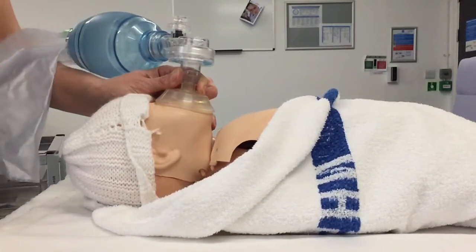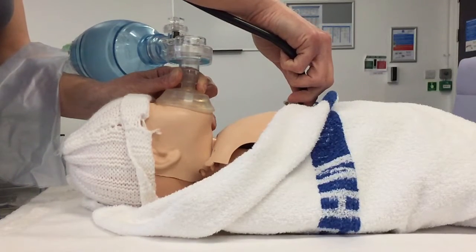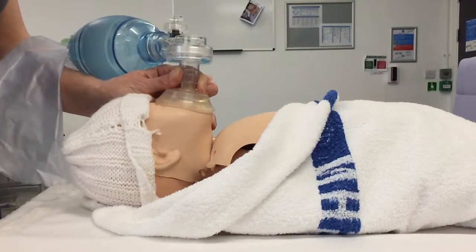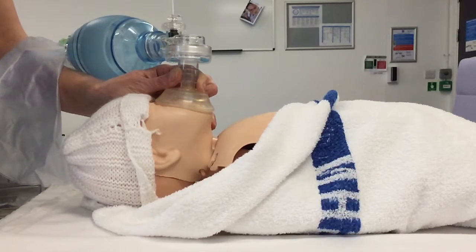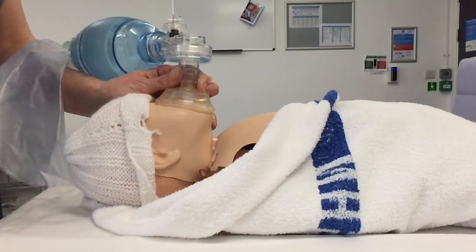Give five inflation breaths, then reassess baby. What's the baby's heart rate now? The heart rate on this baby is slow. Is baby making any respiratory effort? No, it's not. Did I see chest rise with my inflation breaths? We could see clearly that the chest rose. Colour and tone are the same — still pale and floppy.